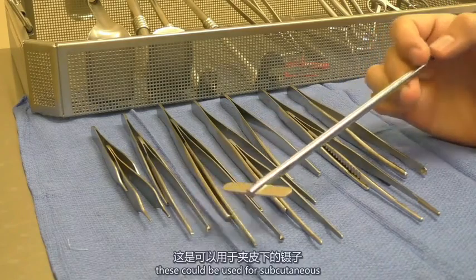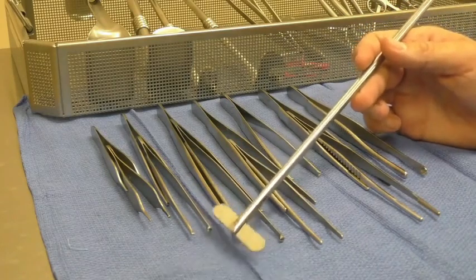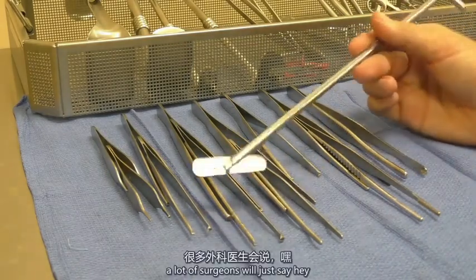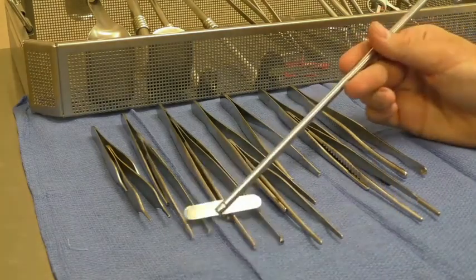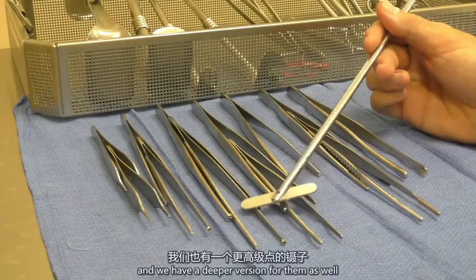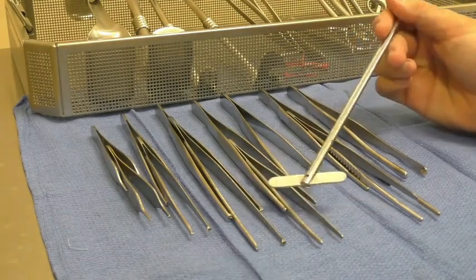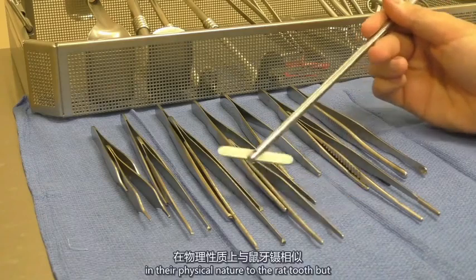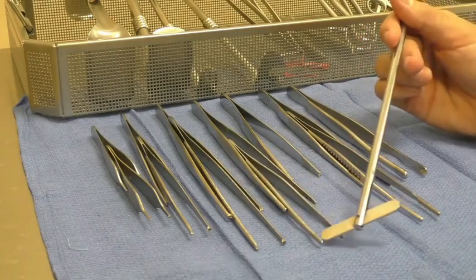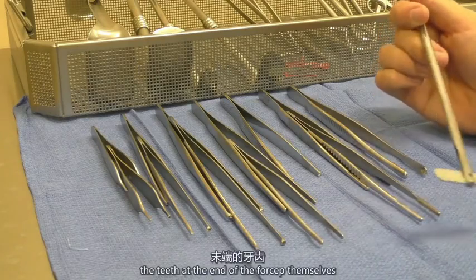These could be used for subcutaneous. They're also known as the rat tooth. A lot of surgeons will just say, hey, you know, give me a rat tooth forceps. This is what they're asking for, and we have a deeper version for them as well. These are similar in their physical nature to the rat tooth, but they do not have the teeth at the end of the forceps themselves.